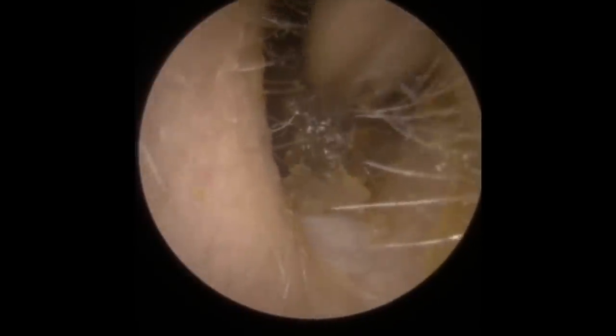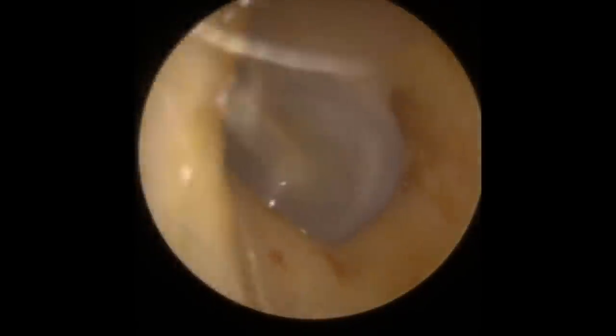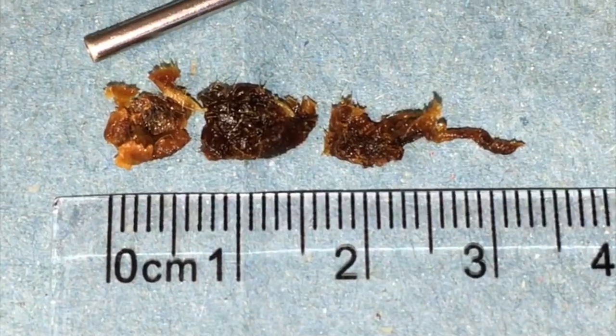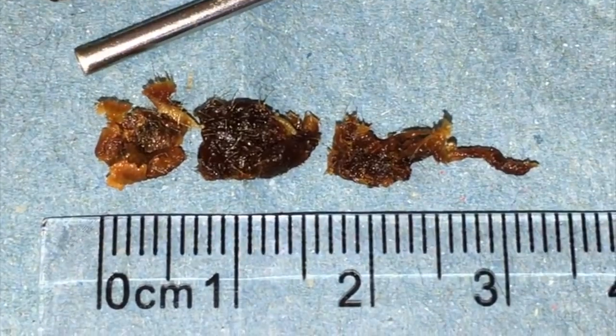Just trying to grab a little bit more. There we go. There's the plug. And we take that away. The eardrum looks lovely and healthy behind. So that's what we removed. You can see we've got 3 quite large pieces of wax there. They've just been causing a few problems.